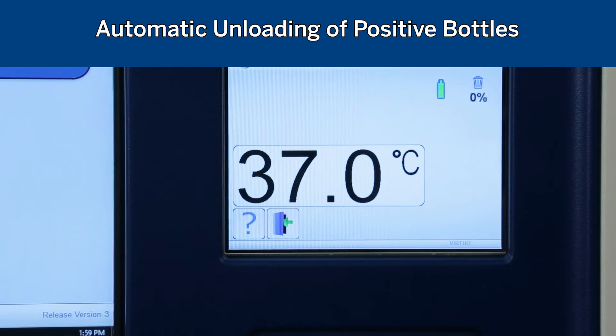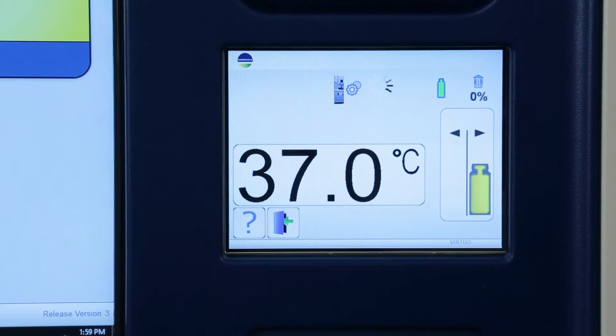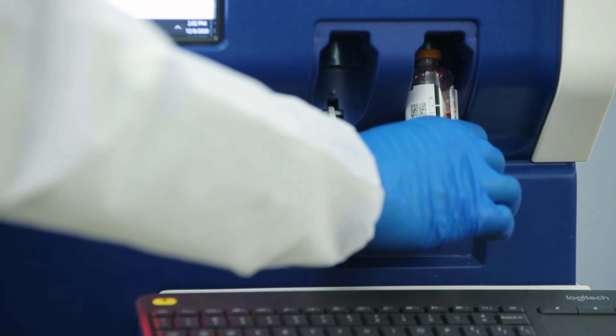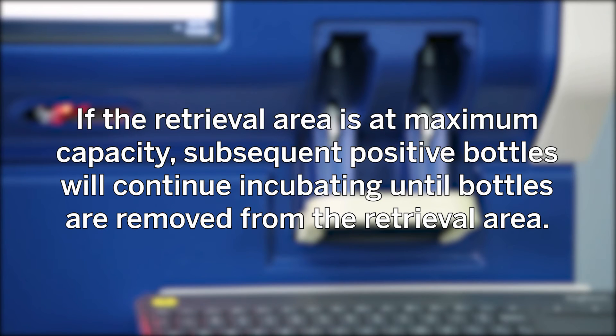Automatic unloading of positive bottles: if your system is set to automatically unload positive bottles, the robot will unload bottles as they are determined positive and place them in the return chute, bringing them to the bottle retrieval area. Bottles are not considered unloaded and the instrument will continue to alarm until positive bottles are removed from the retrieval area. Up to six bottles can fit in the retrieval area at one time, three on each side. If the retrieval area is at maximum capacity, subsequent positive bottles will continue incubating until bottles are removed from the retrieval area.